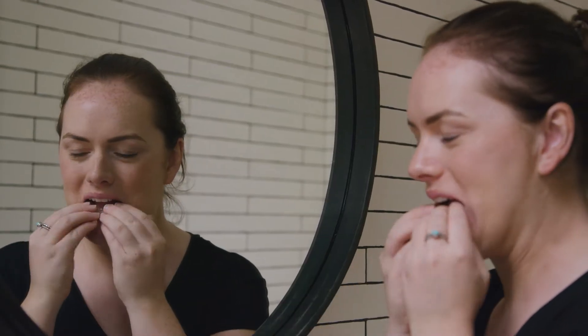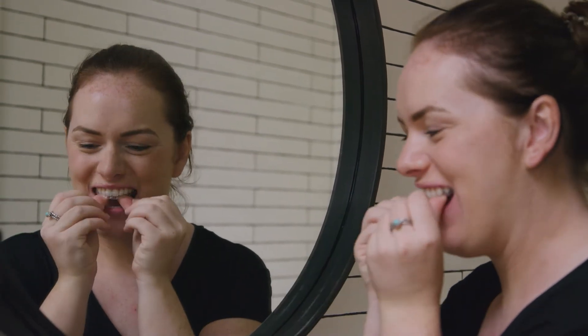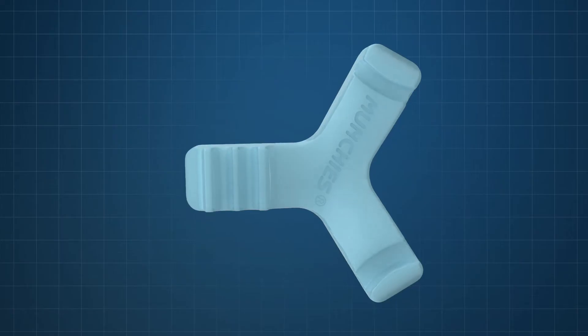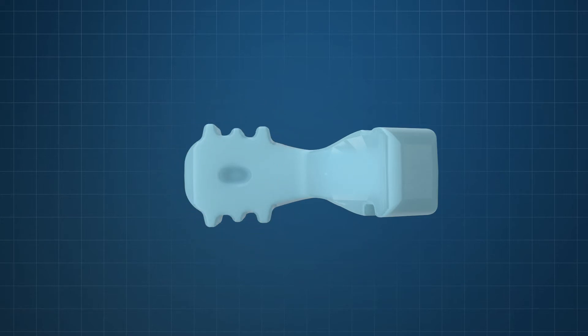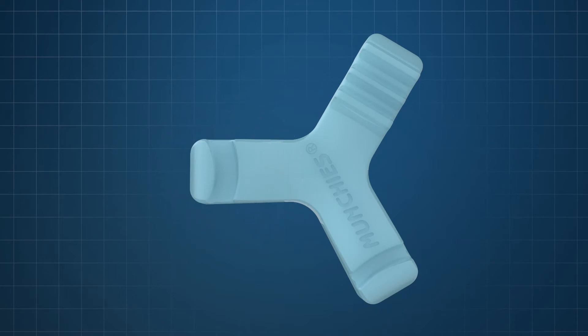The ideal protocol to utilize Munchies EPS is to begin with manual insertion in the canine area, followed by 15 to 20 seconds use of the EPS arm in the premolar region. Horizontal rotation of this arm allows for use of the canine seating well, and finally seating of the anterior teeth.